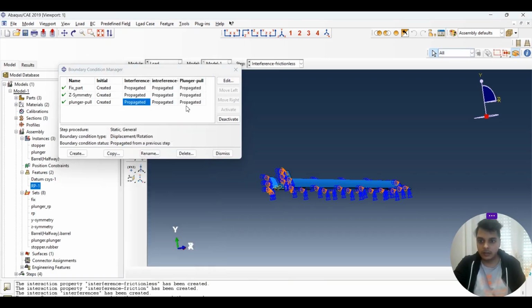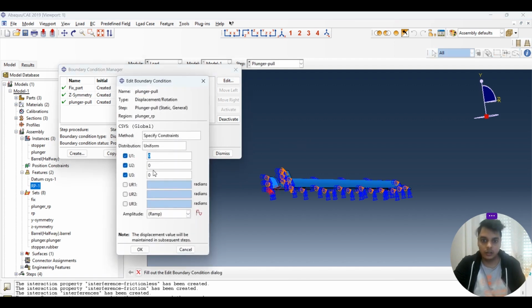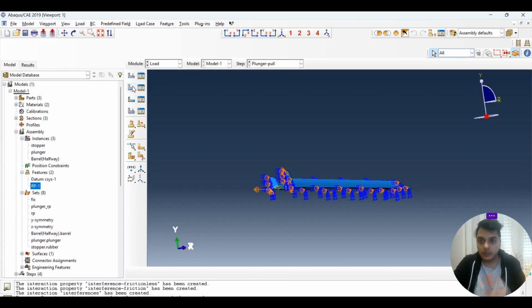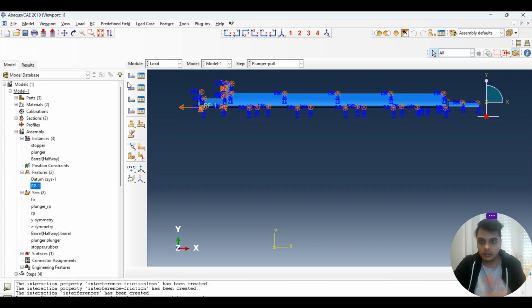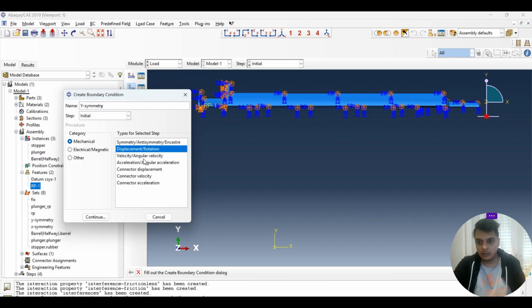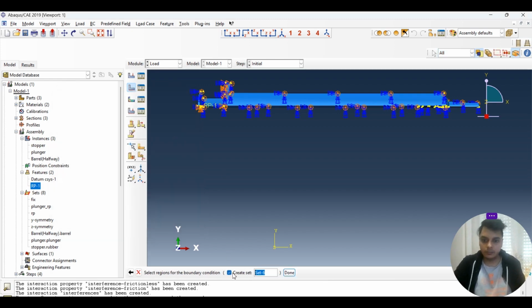Make sure. But once we are starting to pull it, we want it to be not 0, but we want to pull it, correct? So it's minus 25 mm of displacement that I want to put in. So fine. Since I deleted one of the symmetries, I have to redefine that symmetry again. There's a Y-symmetry, so we go here and Y-symmetry. It's going to be the initial, and we select symmetry, select the regions.